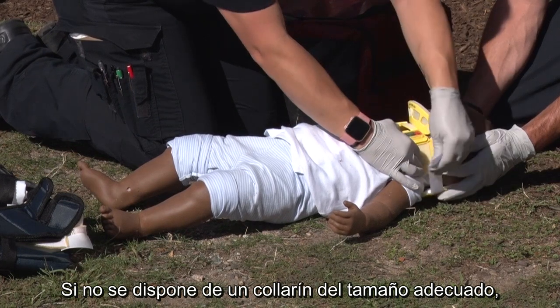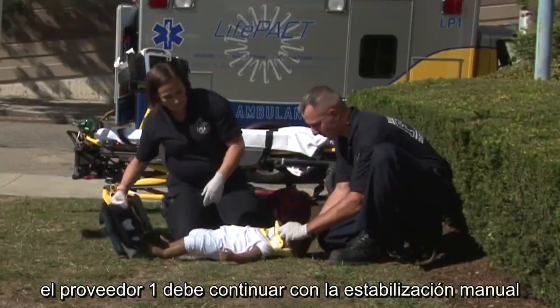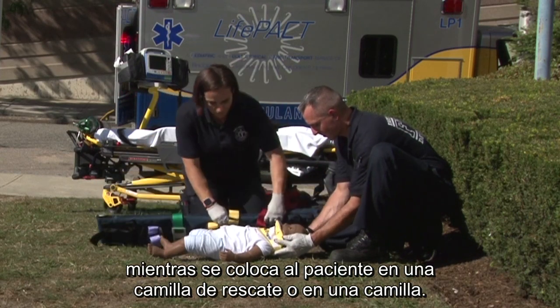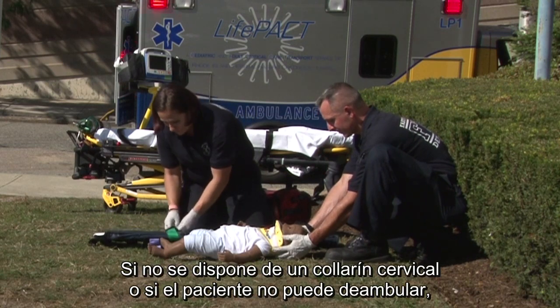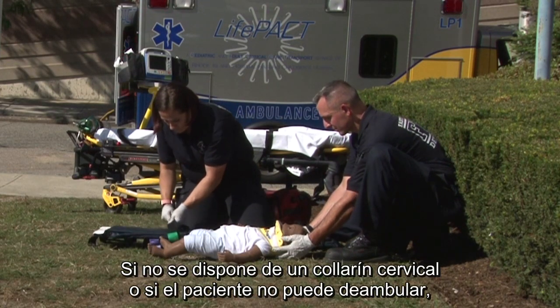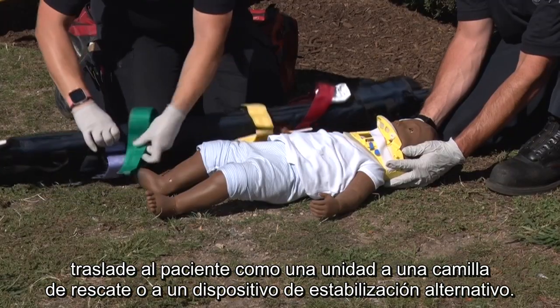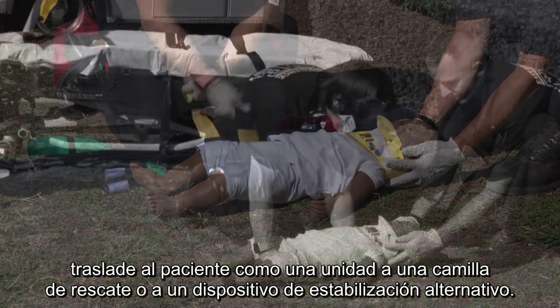If no appropriate size collar is available, Provider 1 should continue manual stabilization as the patient is placed on a spine board or stretcher. If no cervical collar is available, or if the patient is not able to ambulate, transfer the patient as a unit to a spine board or alternate stabilization device.